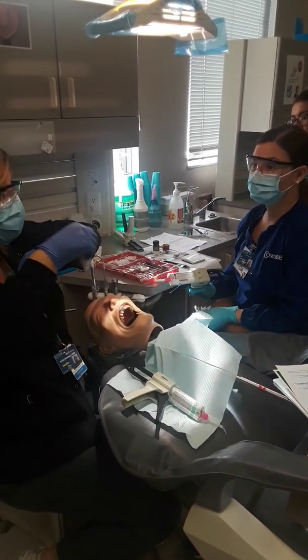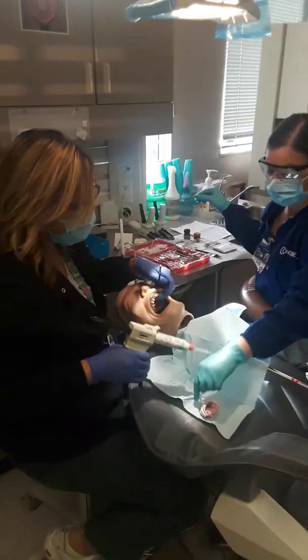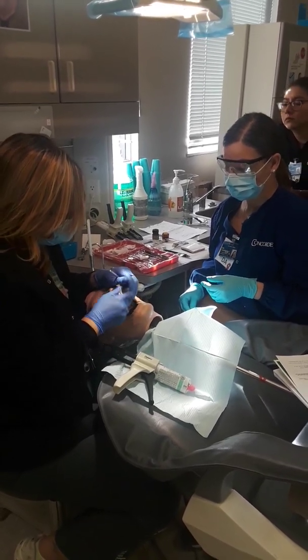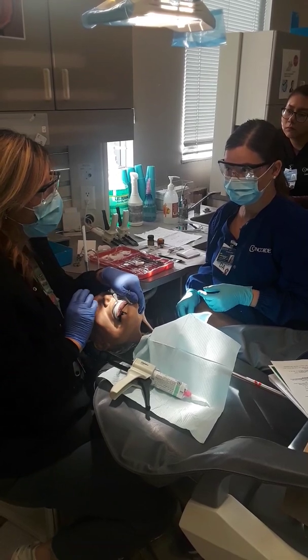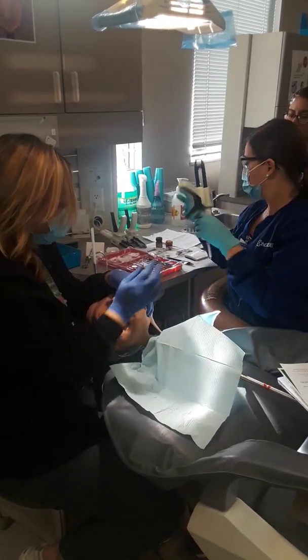So we're like the baking show. We're already ready, okay? So I'm going to squirt this all around the gingiva and in the sulcus. She loads the tray with the pink stuff. I put the pink material in. This takes about 5 to 6 minutes for this material to get hard. So the patient's going to bite normally on this tray. Material gets hard. Don't forget to pass that back.